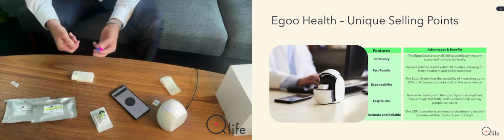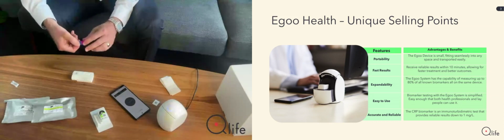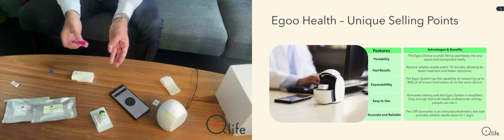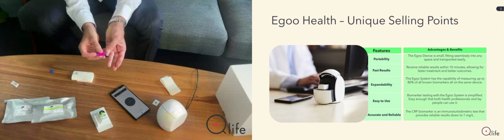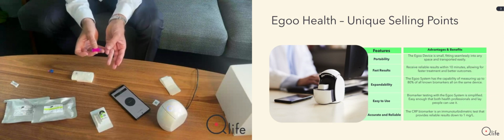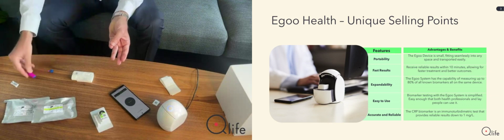So you take the finger tip, and they come in different types of shapes and types. I have one here, which is a medium-sized needle. That's what I need. And you do with the finger stick. It hurts a little bit, of course, but that's the pain you have to suffer to get the data. So you do like this.